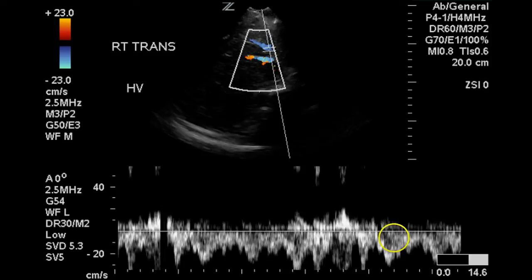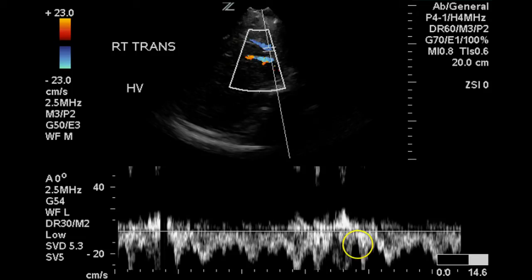Another example — this is the middle hepatic vein, and we can see a little bit of reverse flow due to the atrial kick.